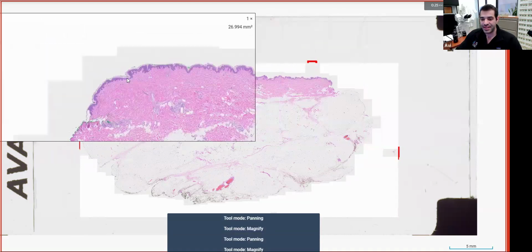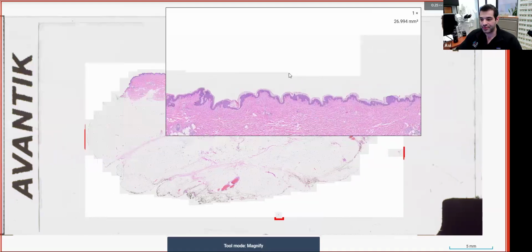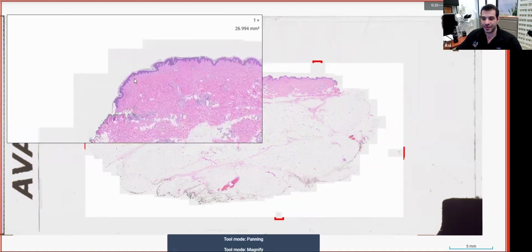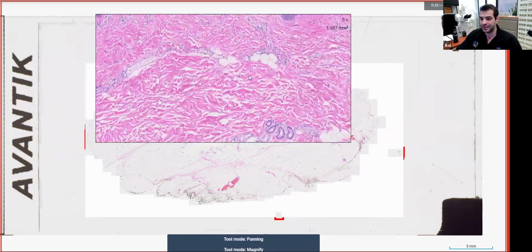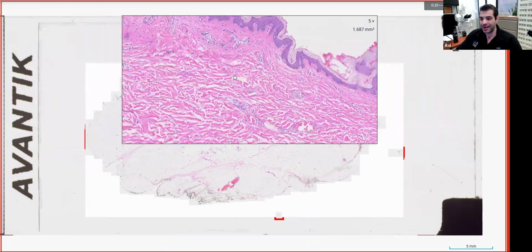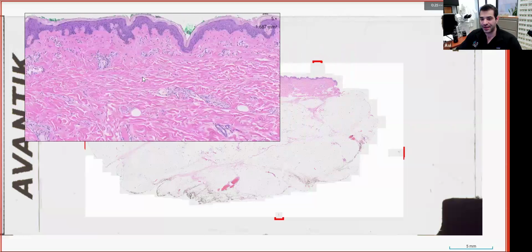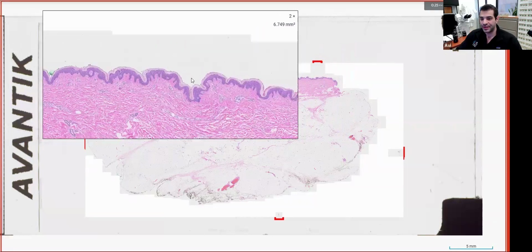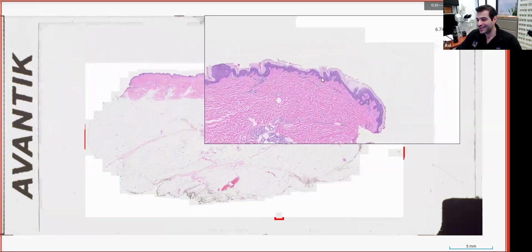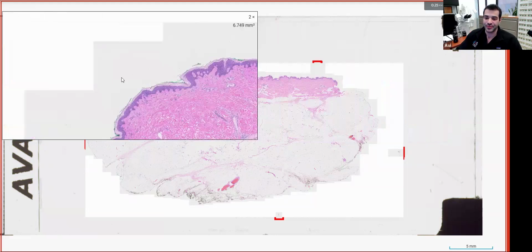And you can see how this is a much quicker pan than what I was doing before. And if you want to do it at an increased magnification, it is still a quicker pan. And it also mimics the type of thing you would do on a regular slide. You can do it this fast on a regular slide. So it replicates, or recapitulates, as some may say, that type of movement.